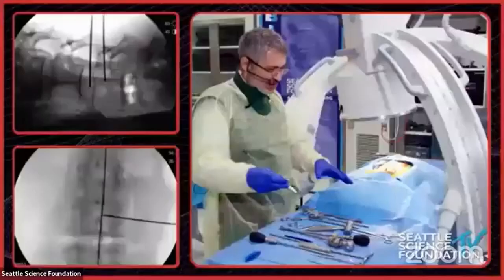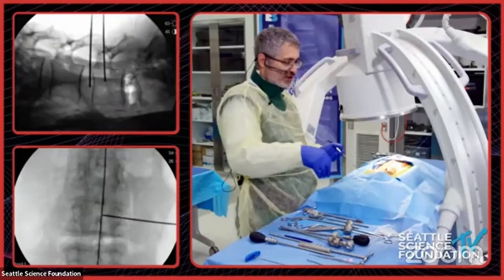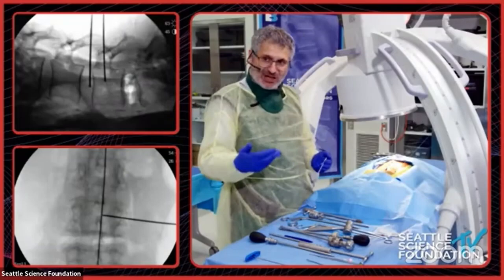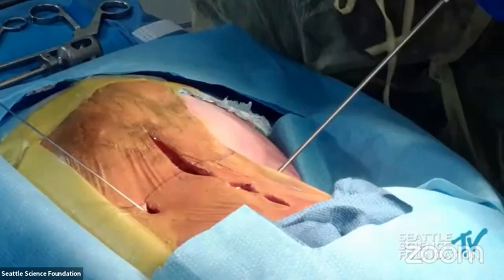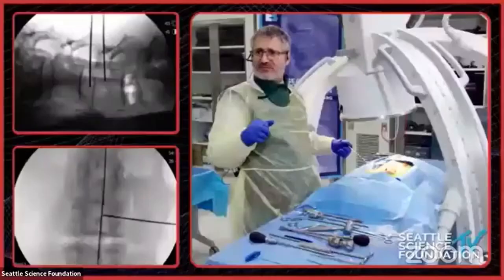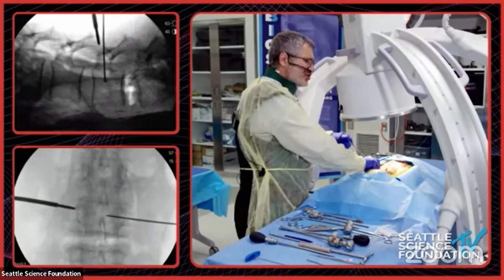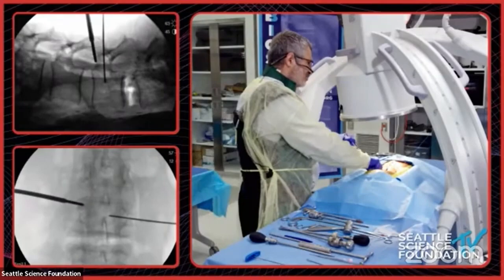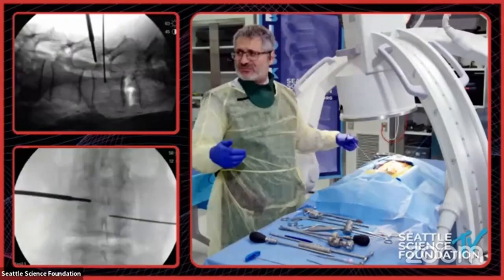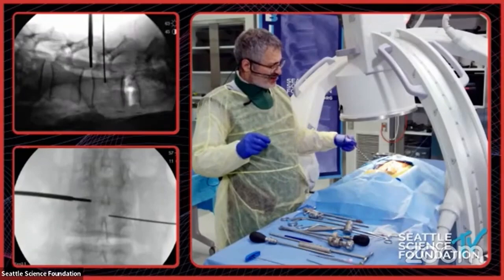The next step is the neuromonitoring probe. We have electrodes in the leg, and we stimulate at 3 milliamp. I'm talking to my neuromonitoring person, and obviously the patient is not paralyzed. We make sure that you have four twitches before we start. We go at 45 degrees. This is a very skinny patient — most of my patients are about three times this size. I'm hitting the pedicle of the level below, and while I'm stimulating, I run it down the pedicle.